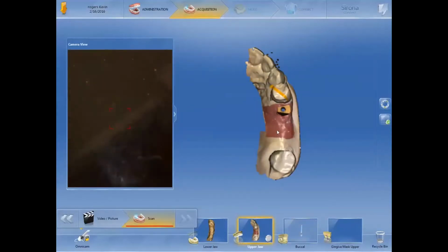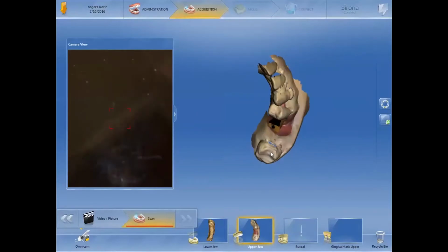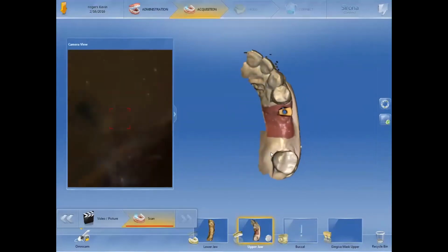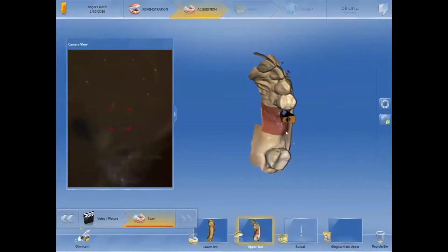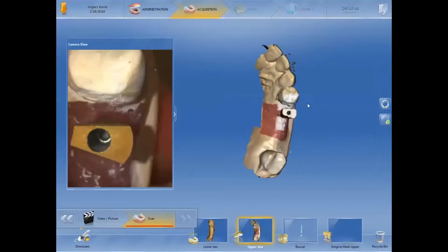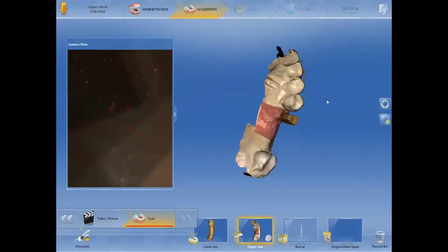I'm going to rotate, see if I see any open areas. There's one towards the top there. Fill that one in quickly. Oh, you can also see on the top of the scan post, there's an open area, mostly blocked by this tooth here. Very difficult to see. See if we can fill it in a little bit though. Much better.